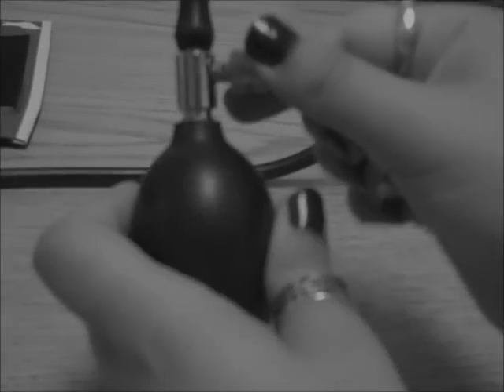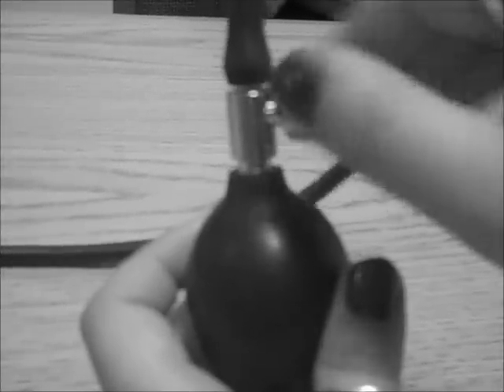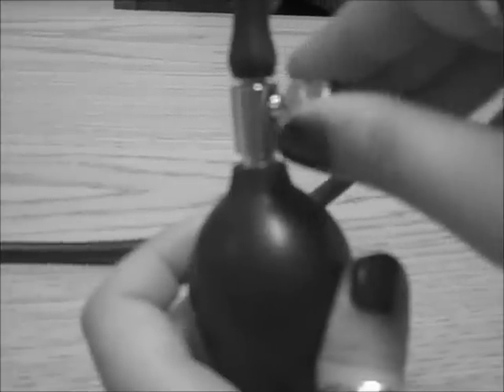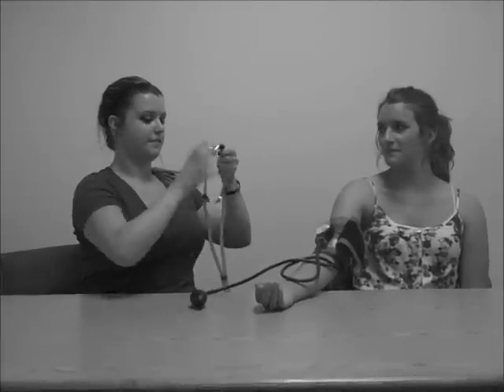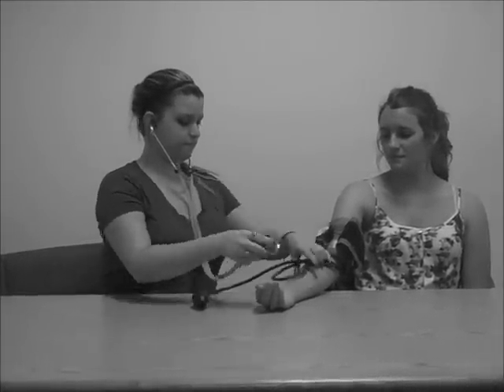To close the air valve, turn the valve toward you until tight. To open the air valve, slowly turn the valve away from you. Place the stethoscope underneath the cuff in the antecubital and pump up the cuff until the pressure reads about 180 millimeters of mercury.